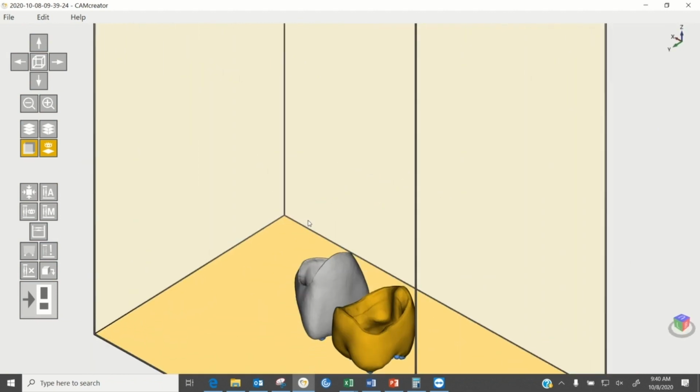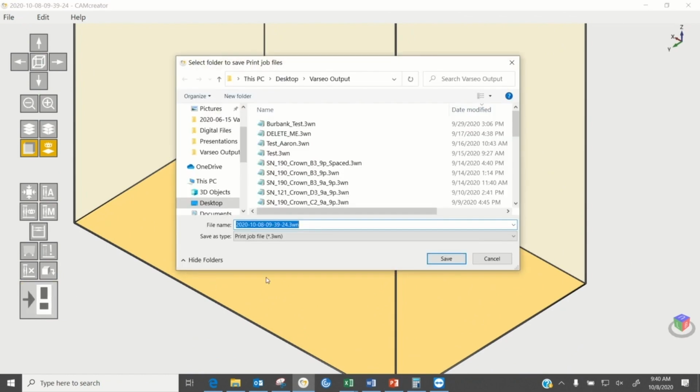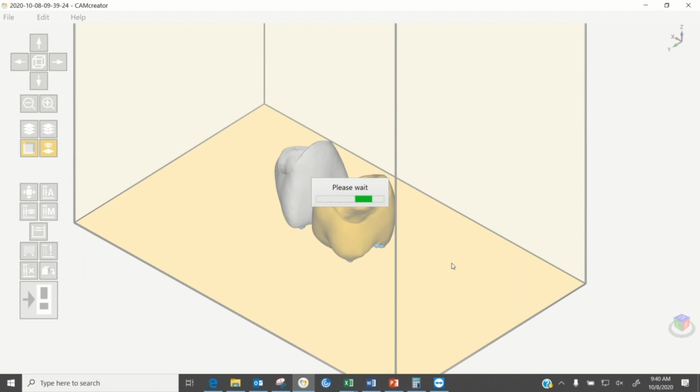You can just click the output button and it's going to ask you to save the file, and then it will start transferring to the printer.